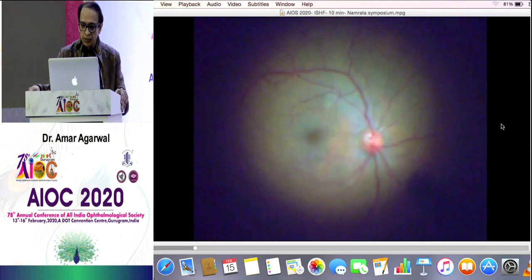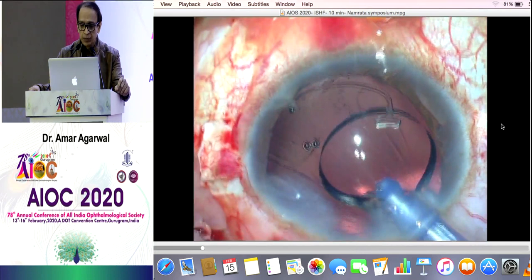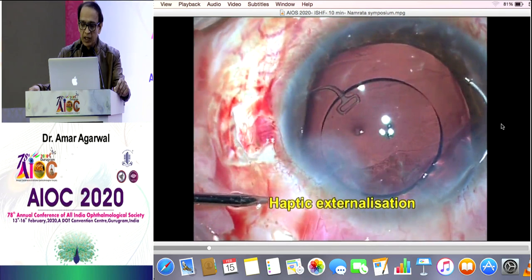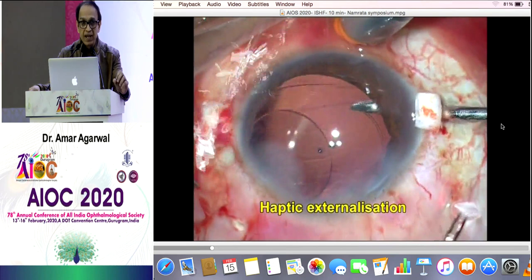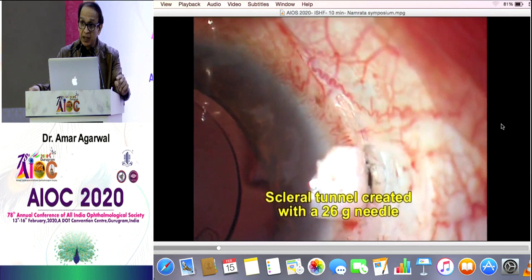Now remember, the glued IOL, if you're doing, you need a three-piece IOL. And for a multifocal IOL, there's just one company which creates that, and that's the AMO or the J&J lens. So these lenses are three-piece lenses and can be used for gluing the lenses inside. The advantage here is you can see the first haptic out. Now I'll do the handshake technique and I can do the second haptic out. As I said, the basic advantage is you are creating a multifocal glued IOL. You can fix those rings where you want it. Remember that. If you put in a bag, you can't tell where the ring is going to be.